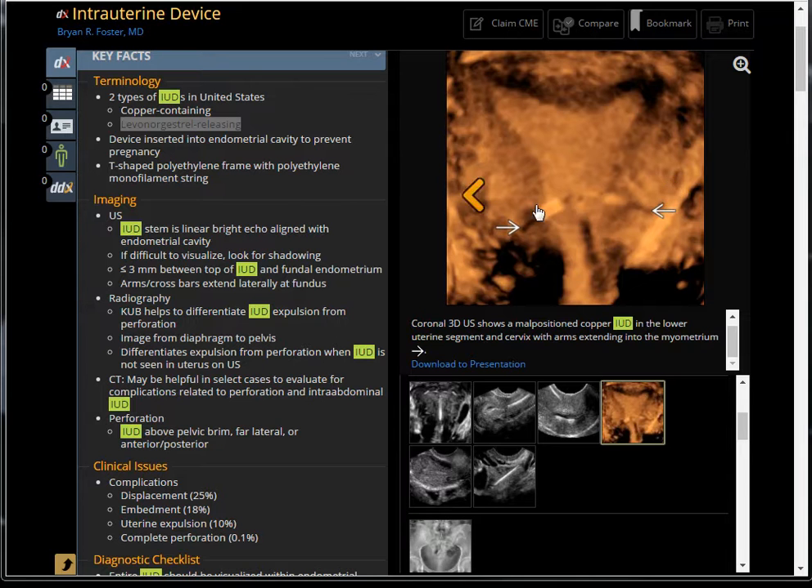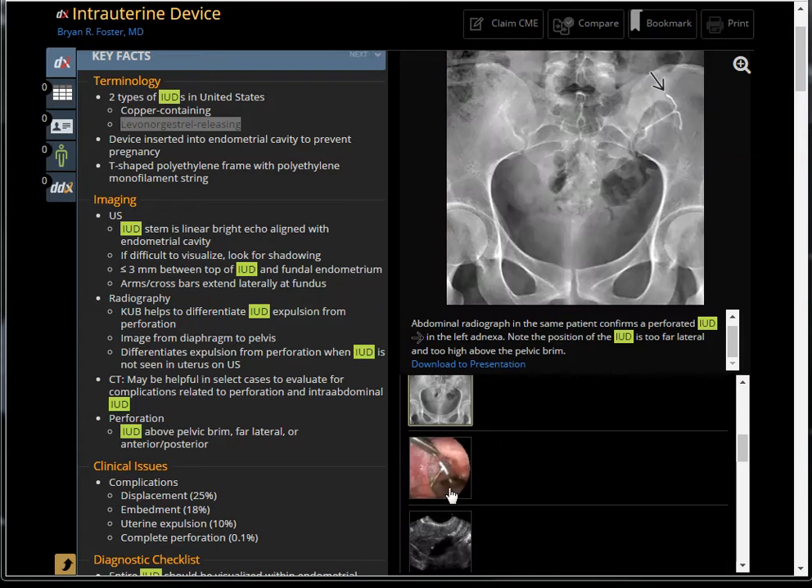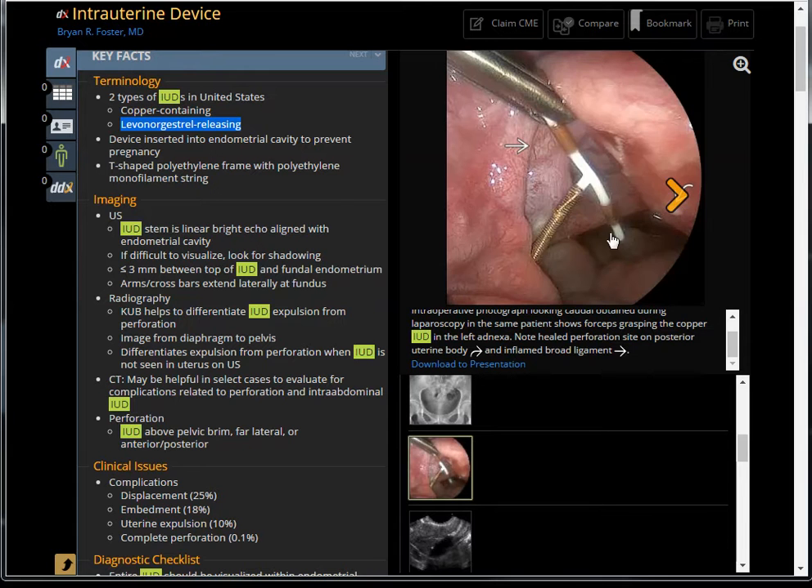This one is too low — the T-shape should be here. However, the arm is kind of perforating, embedded in the myometrium, and the stem is in the cervical canal. Sometimes they can cause a problem: they perforate through the uterus and migrate into the pelvis. This one has migrated to the left side, so it's better identified on X-ray since ultrasound sometimes cannot detect it. It used to exit through a hole that later healed, and the device is now freely located in the peritoneal cavity, irritating the adjacent anatomy.